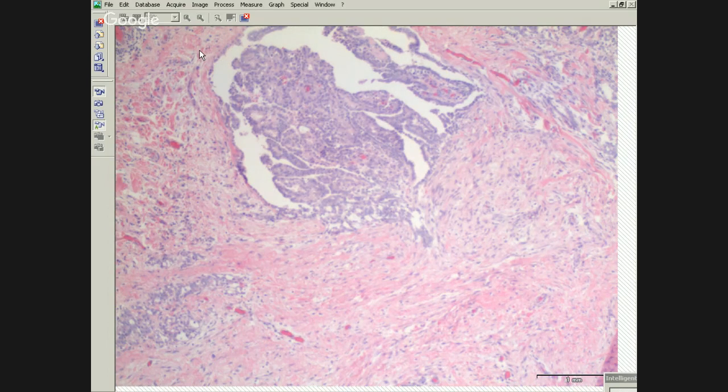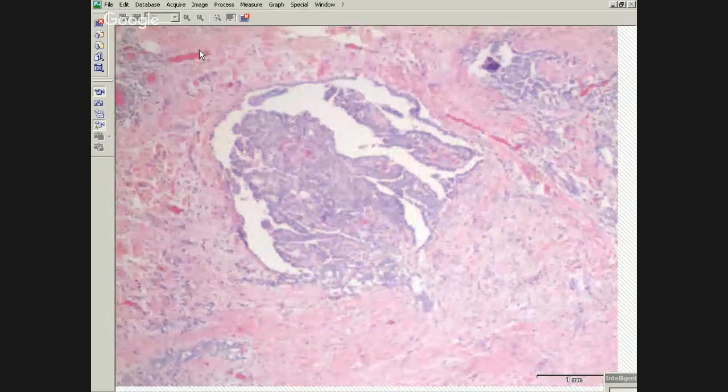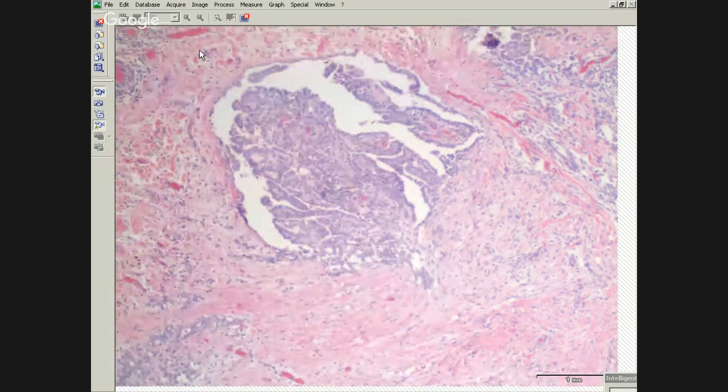I also usually get a keratin in a case like this where you have well-developed papillary structures. Making sure you're entertaining the right differential between mesothelioma and adenocarcinoma isn't as critical here, but you'll see in some of the other cases where it has a different type of growth pattern, it is important. And the keratin can also highlight infiltrative areas you might not appreciate on the H&E, if you're having trouble even deciding if something's benign or malignant. So getting a keratin is a good first step.